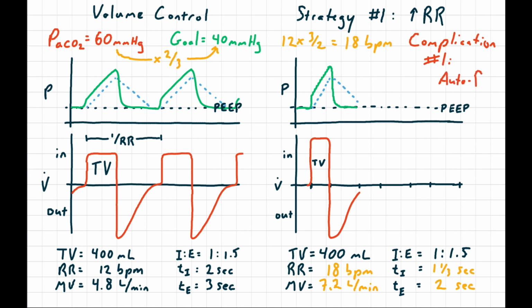The reason for this is that the ventilator is ready to start its next inhalation, so we begin our flow-limited volume control breath. Circuit pressure will again rise to a constant delta above pulmonary pressure, and we wind up in a situation where, because our pulmonary pressure and pulmonary volume never quite return to baseline, the peak pressure is going to increase a little bit with every breath until we reach a new equilibrium.